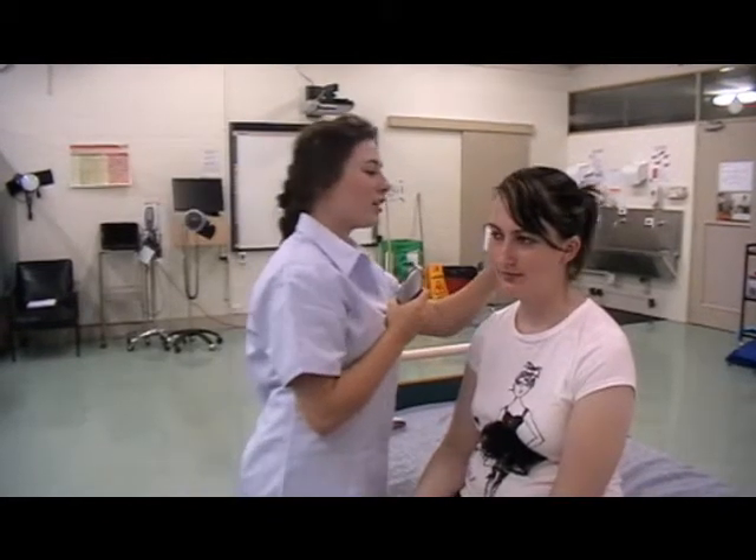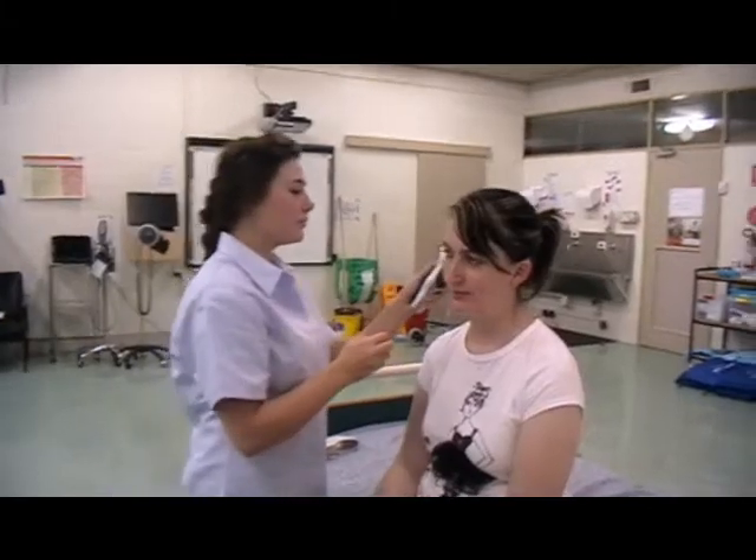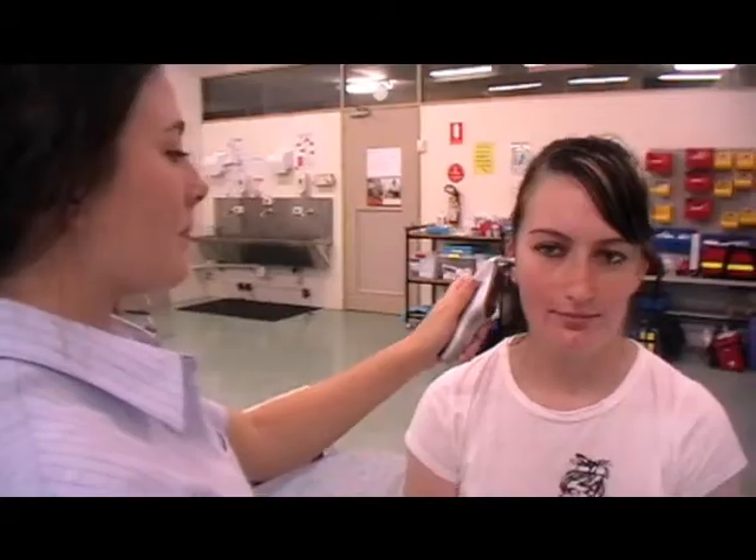Today I'll be taking your OBS and first we will start with temperature. I'll just check you for any earwax to get a correct reading. Your temperature is 37.1 which is in the normal range, the normal range being 36 to 38 degrees. You are afebrile.